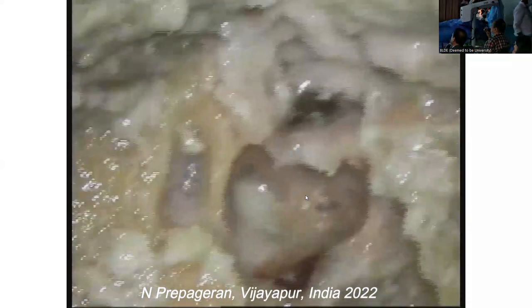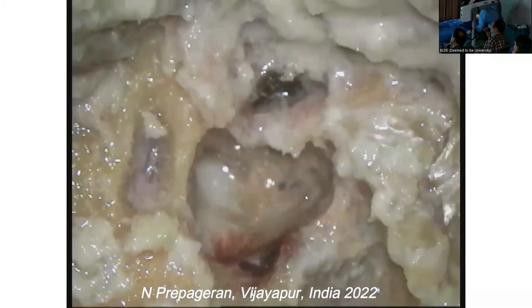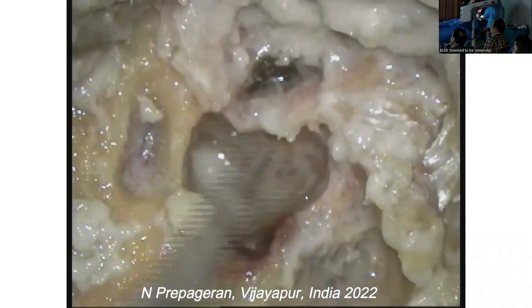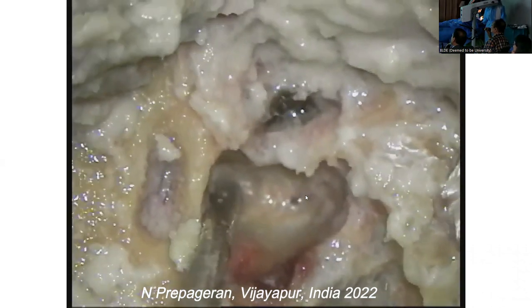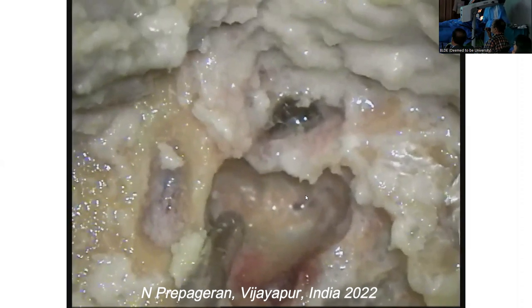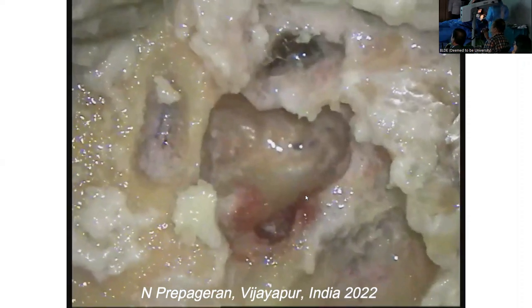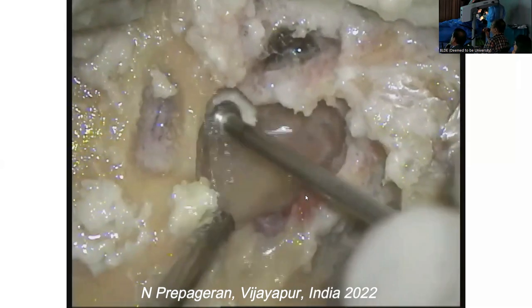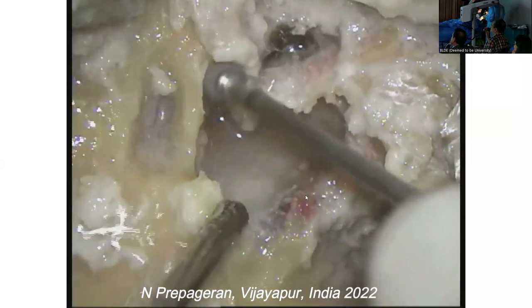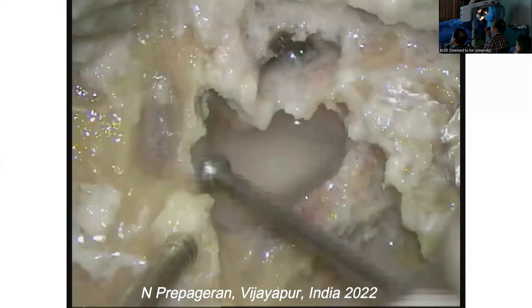Let me make this center again. Focus this one, right? This one. Okay, is that clearer now? Yes. Yeah. Better, right? So now, I'm going to remove the attic region and identify the middle fossa.